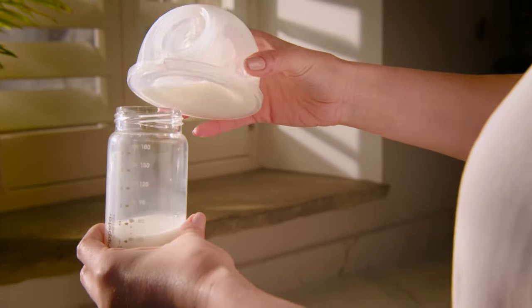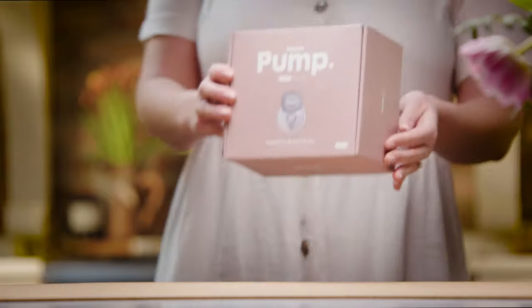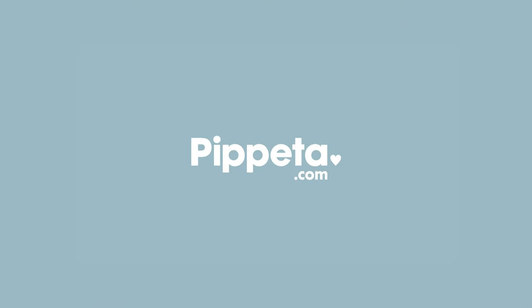To empty your cup, simply remove the motor and pour from the pouring hole. For more information, please refer to the manual or visit us at pippeta.com.